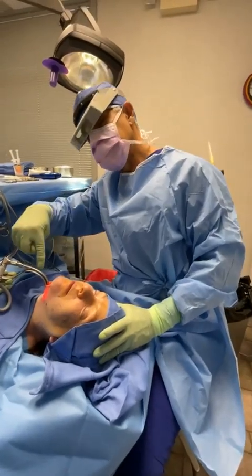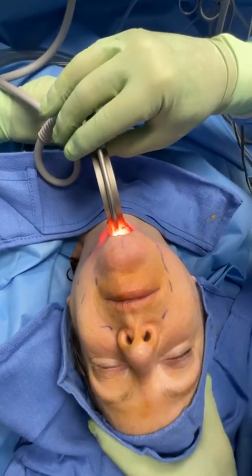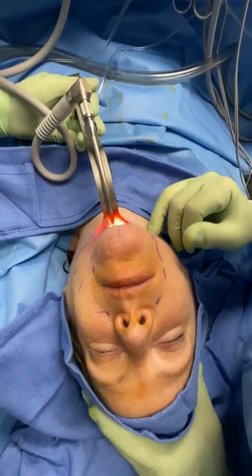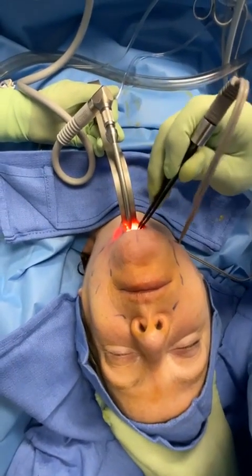If you move the camera here, you can look down in there. All right, so this is the skin of the neck plus some fat on the underside, known as the subcutaneous fat, and then down below that is the platysma muscle.